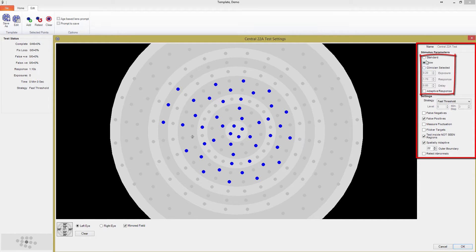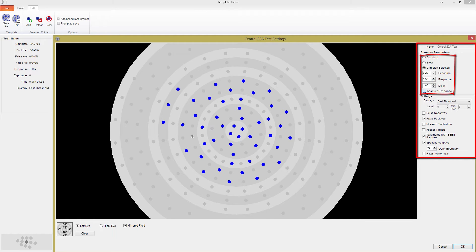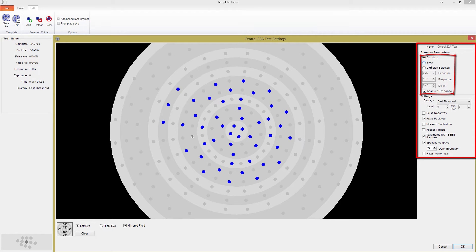In keeping with the idea that you really can customize anything you want with your M700 perimeter, the clinician selected button lets you control all three of these parameters. The adaptive response option adds a bit of flexibility to the parameters set above. It modifies the response and delay parameters to better suit the patient, speeding up for fast patients to reduce test time, but slowing down if the patient has a hard time responding in time.